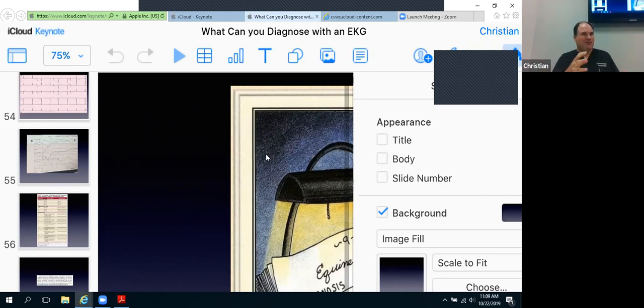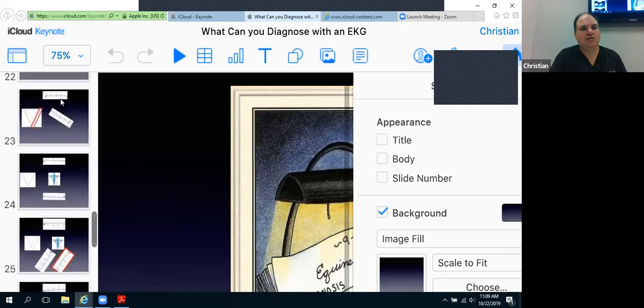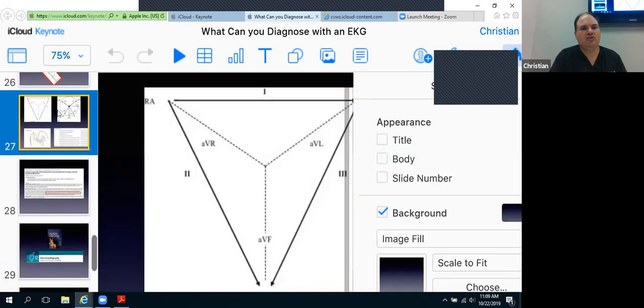Then you have to think about what happens if the electrical signal is weaker, and what happens to all of those different angles. That's how we define the different regions of this. So if I go back to that regional approach here.